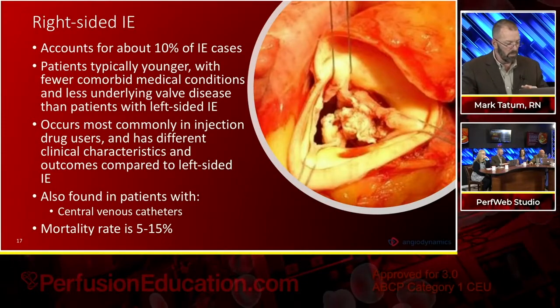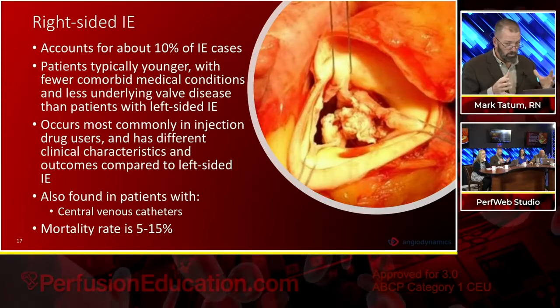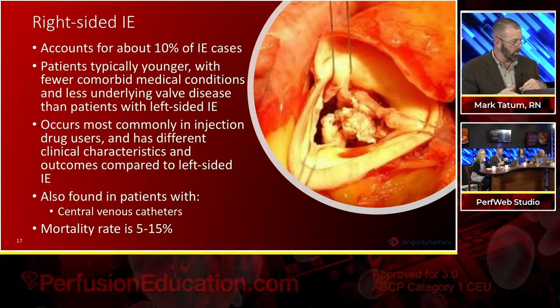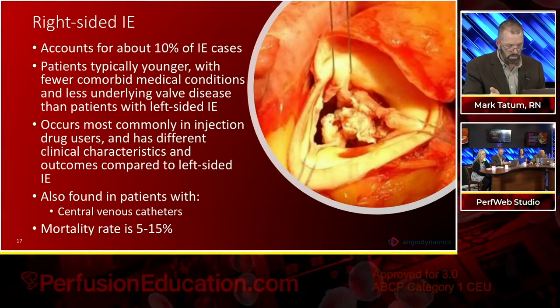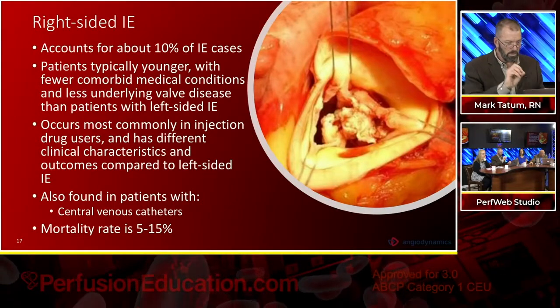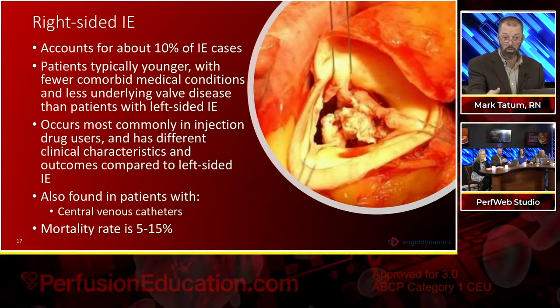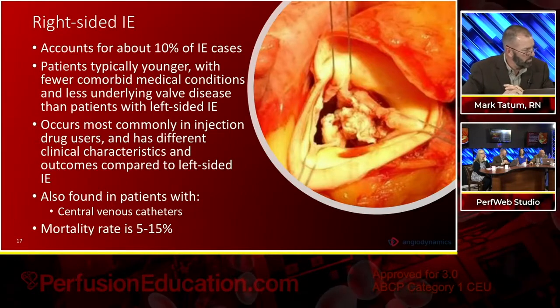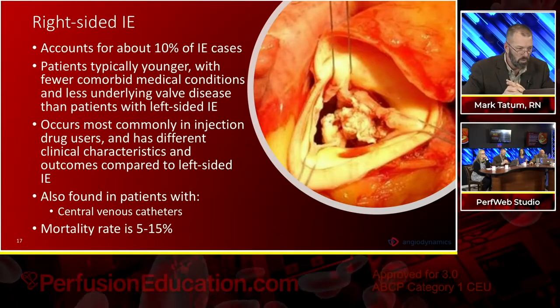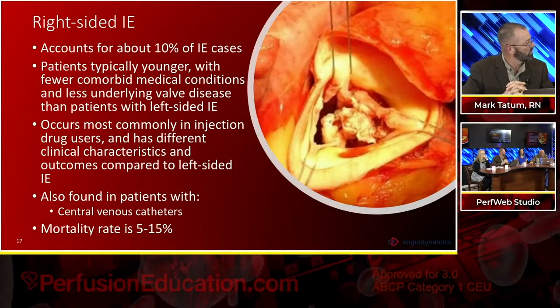Incidence, as an example, the AngioVac cannula was used in a short series of patients done at a university in the U.S. And the physician who did this study of 40 some odd patients was able to treat successfully using AngioVac as the treatment modality to be able to remove or debulk the vegetation. But in 45% of the patients, the tricuspid regurgitation was worse after the AngioVac case than it was before.